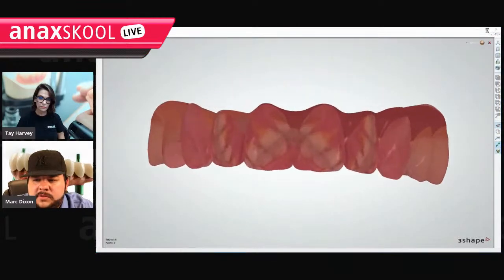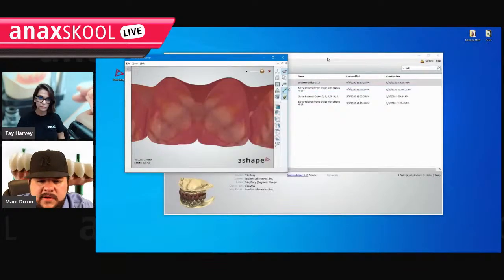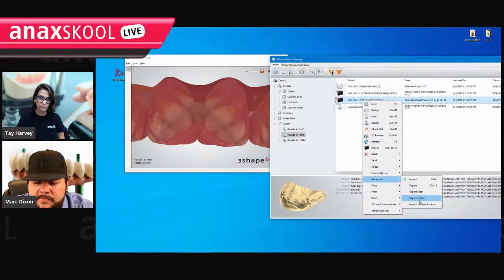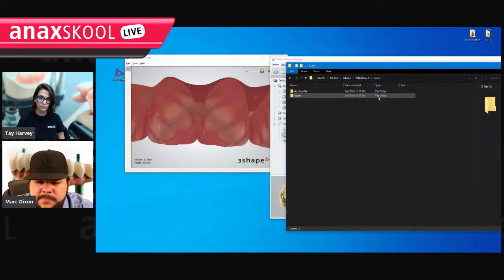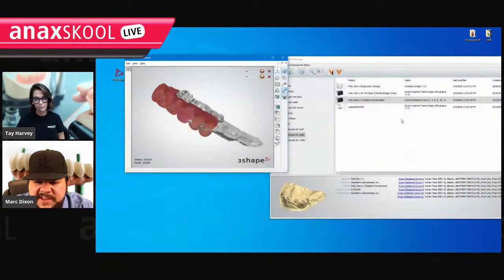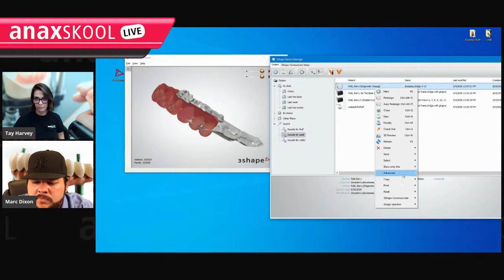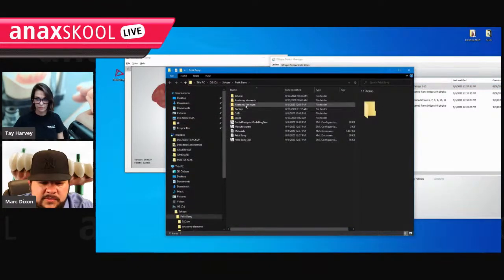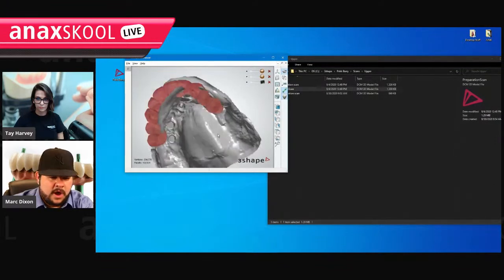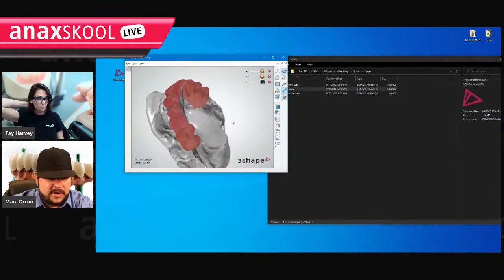That's all we need. But why is my CAD file with implant coordinates so wrong? Because it shouldn't be. Totally wrong. So it's fine. I can fix it and they'll learn too. So I'll show you guys what the problem is. Our scan with the implant coordinates is not aligned to everything.